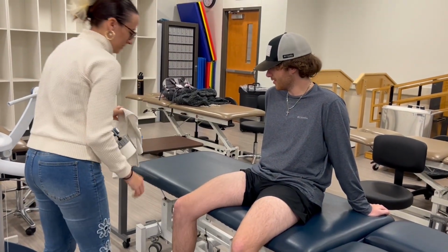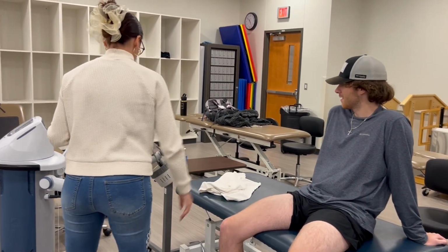Here we are performing a skin check post-use of shortwave diathermy to make sure there is no adverse responses.